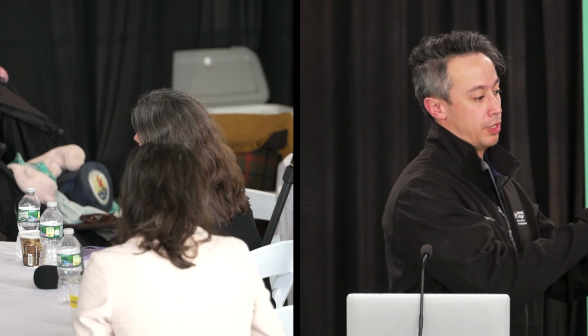But if we added these metrics in, your slope looks like a non-progressor. The texture of your lesion from before treatment to after has changed. Then you get more certainty in thinking, okay, I think your disease is going to stop, versus did you escape transplant and we have to do it a second time, or in the era of gene therapy, for whatever reason the gene therapy doesn't take, then you have to go to transplant, or vice versa, right?